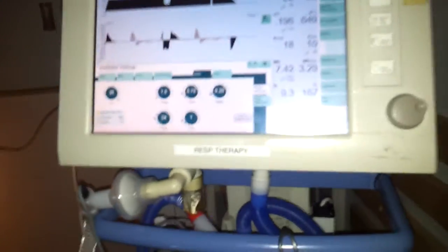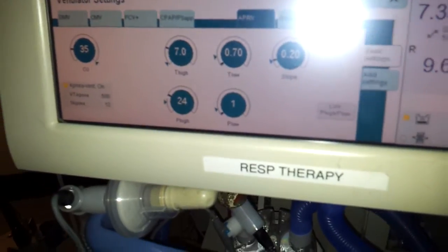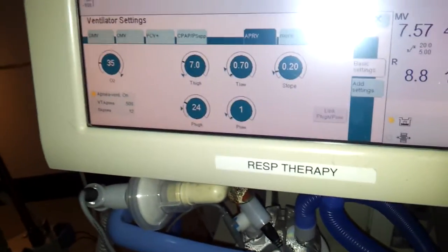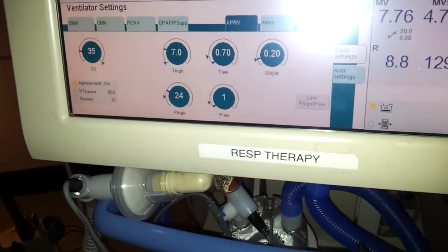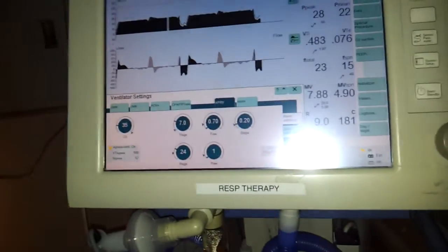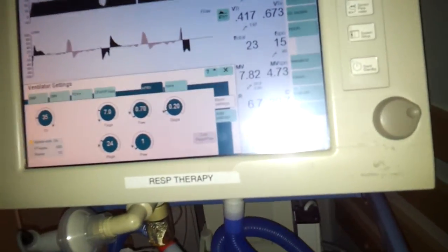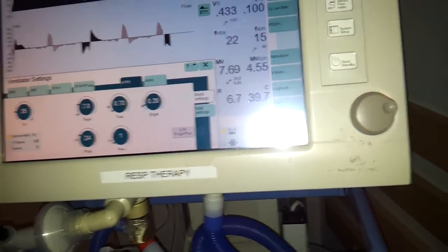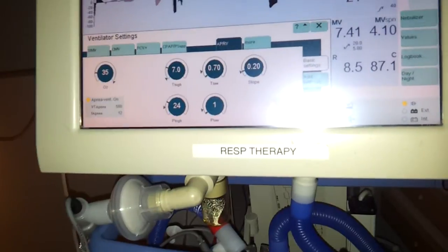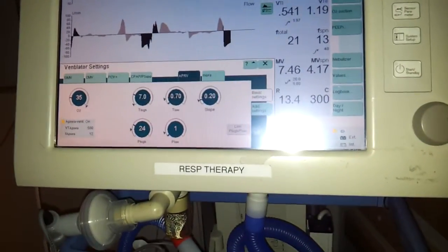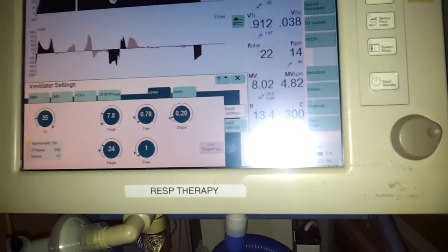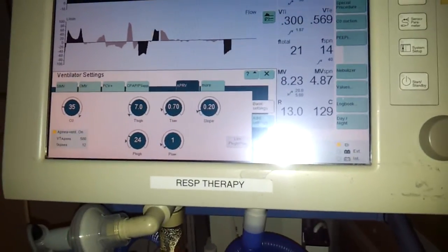For settings, you have four main settings: P high, P low, T high, and T low. Most of the time is spent in P high to recruit alveoli and keep them open to improve oxygenation. To start, set P high at plateau pressure — if plateau is greater than 30, your starting point would be 30. T high is a minimum of 4 seconds; here we have it set at 7. Set P low at 0, or 1 in this case, to avoid resistance to exhalation — you want to blow as much air out as possible in that short time. T low is usually set at 0.5 to 0.8 seconds, very short to avoid derecruitment.